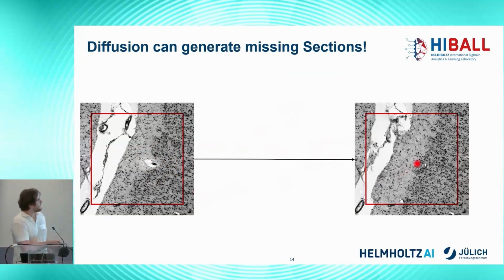As you can see, there is no blood vessel here, or maybe only a small one. In addition, the tissue border also seems wrong, so to say, and the laminar structure is also wrong. So these are all things where the cell statistic is correct, but it's not good enough.